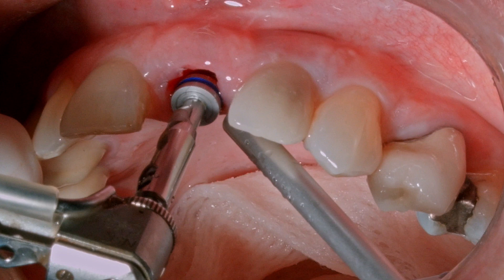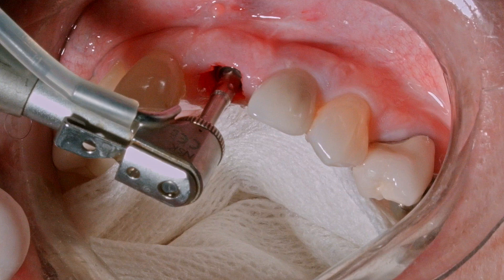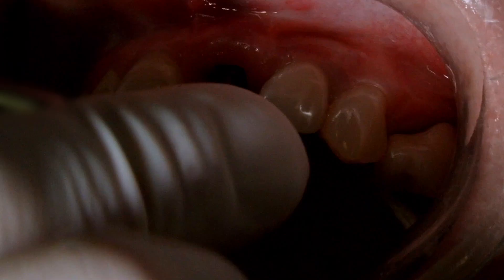Here we're going directly from the number two multi-drill to the number four multi-drill. The multi-drills have a highly engineered cutting capacity and are engineered to match the implant size with excellent precision. We'll see that the implant is able to go into the bone relatively easily but establishes a high primary stability at placement depth.